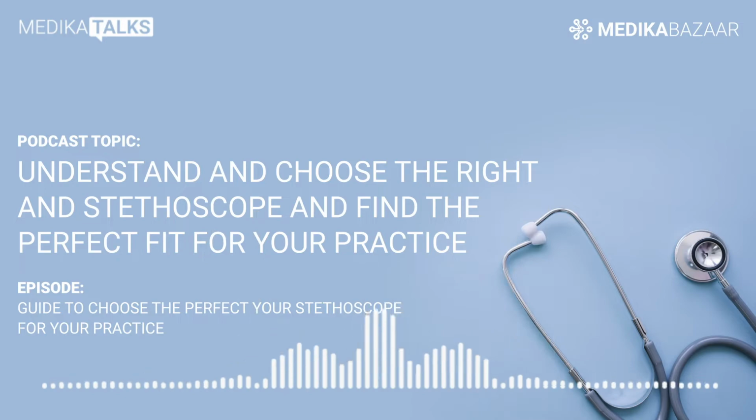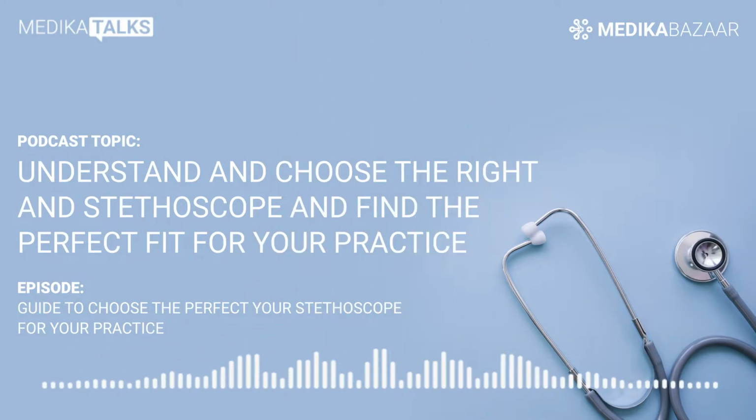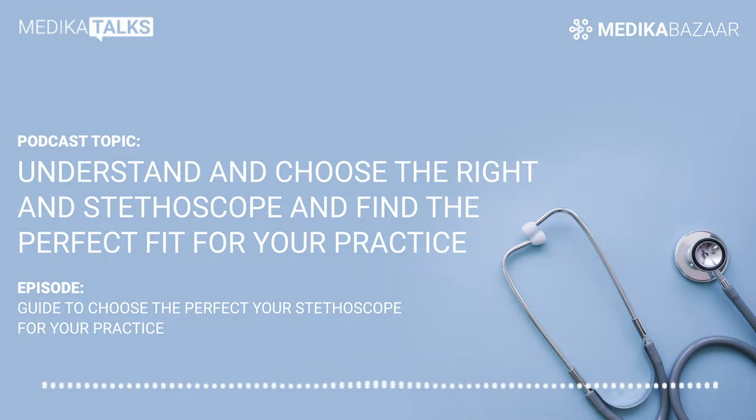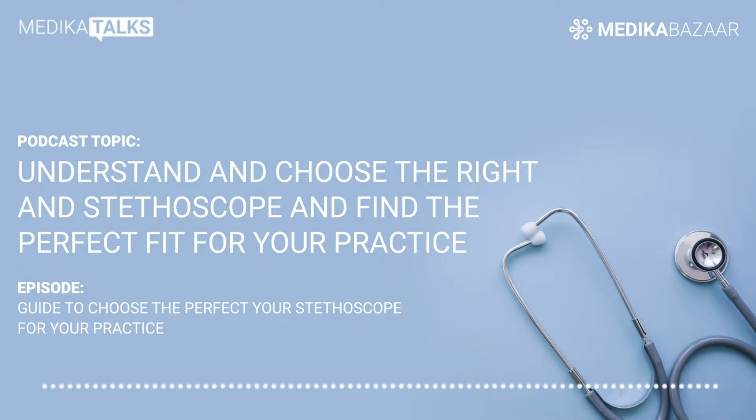optimal for listening. Electronic stethoscopes are battery operated and most have warning systems to let you know when the battery power is running low. Some electronic stethoscopes have a digital display to show the battery status, heart rate and volume levels. Some even have ports or an infrared device to let you connect to another electronic stethoscope, computer or personal digital assistant.